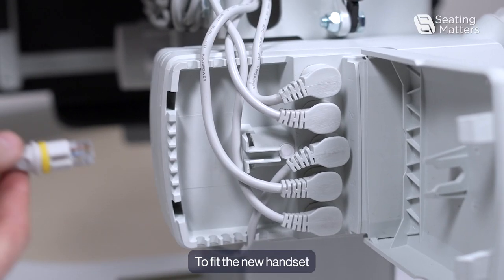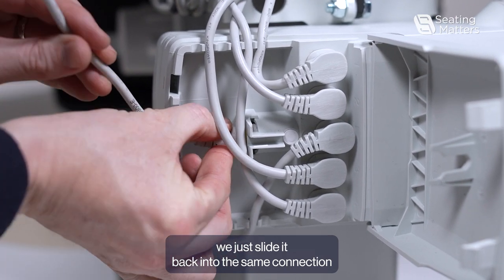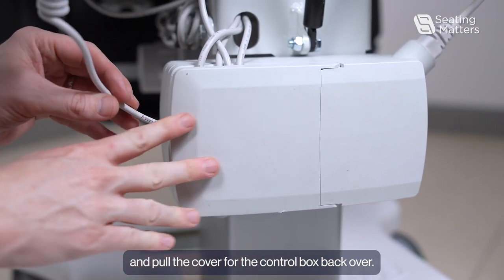To fit the new handset, we just slide it back into the same connection and pull the cover for the control box back over.